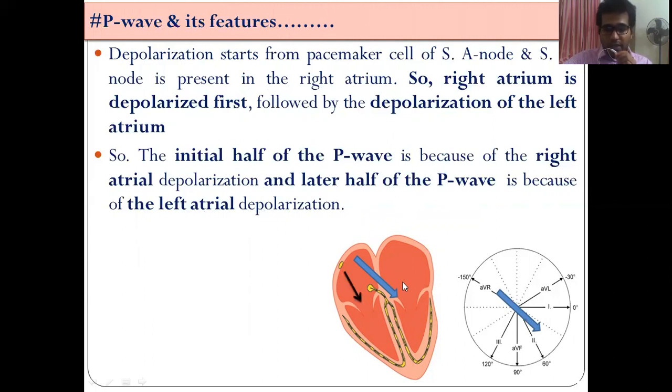Here you can see the direction of the depolarizing current, with the right atrium depolarized first and then the left atrium.